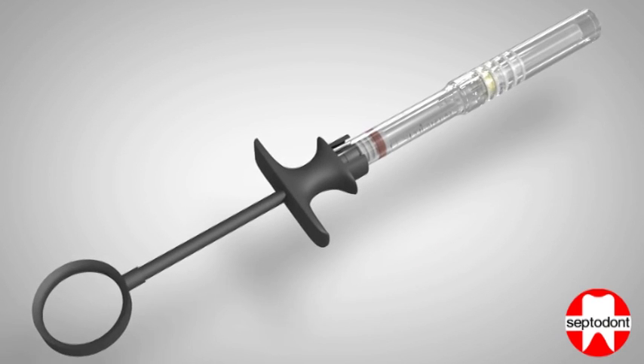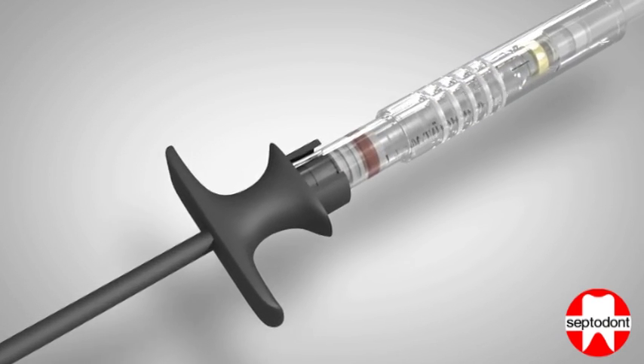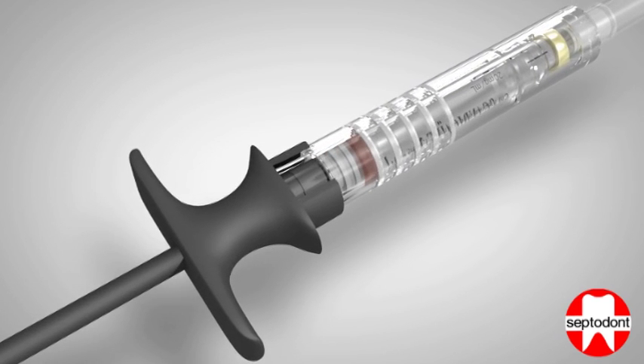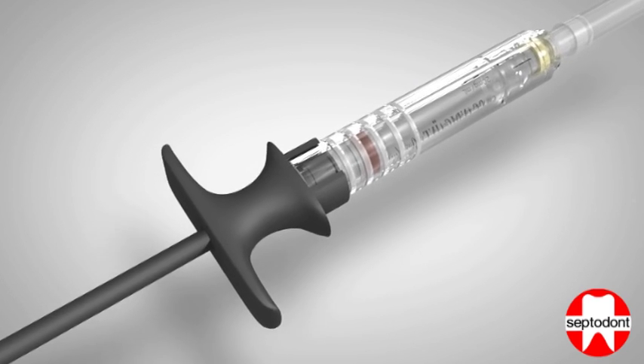Step 3: Slide the sheath protecting the needle backwards towards the handle until it clicks firmly. The click is made as the sheath hits the handle and locks the unit together.